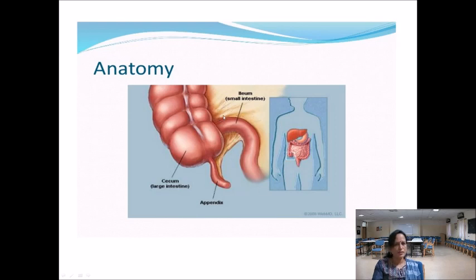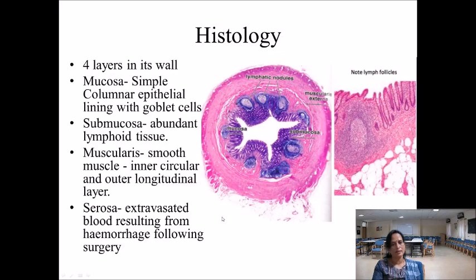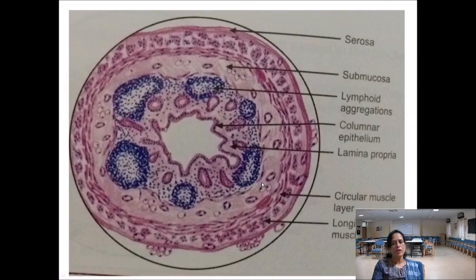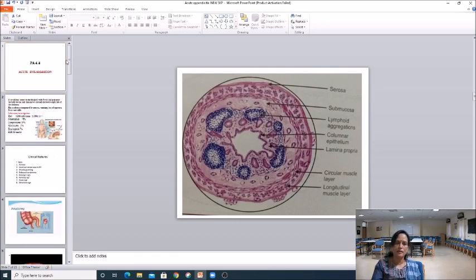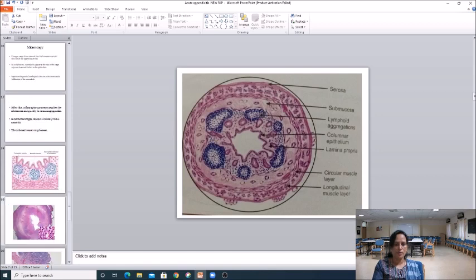Okay. So what was the diagnosis? The disease was pertaining to this particular organ. Okay, vestigial organ we say. It's not present in animals, only humans have it, and it has no use also. So the clinical diagnosis was acute appendicitis. Fine. So today we are learning about acute appendicitis and its gross and microscopic features. This is taken as an example for acute inflammation.